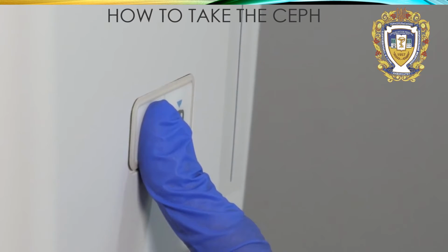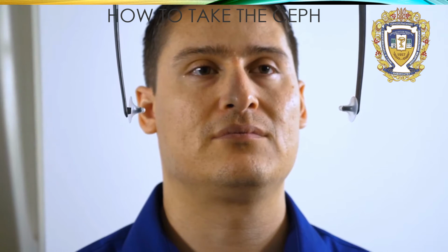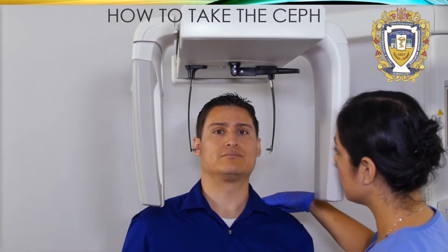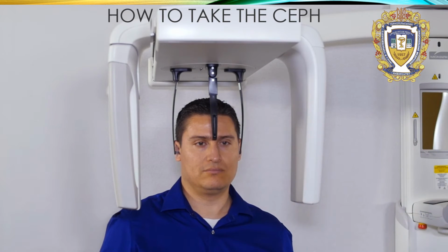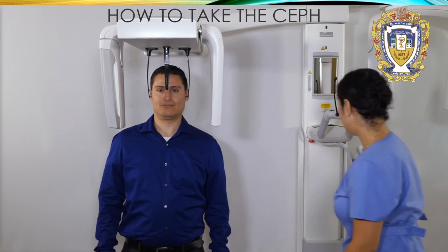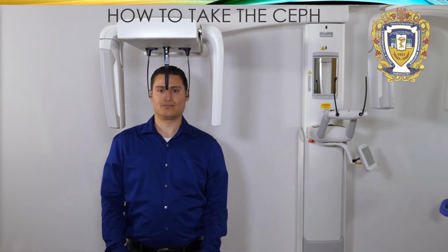Using the up-down control buttons on the secondary collimator or on the side of the patient positioning table, adjust the height of the Vantage system until the ear posts are approximately level with the patient's otic canal. Grasp the Nasion and slide it vertically until it aligns with the bridge of the patient's nose. Slide the Nasion toward the patient's nose until the tip contacts the bridge of the nose. For projections where the Nasion is not needed, it will rotate about the base out of the projection area.